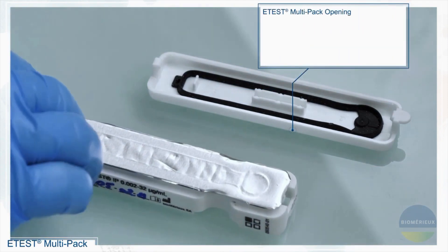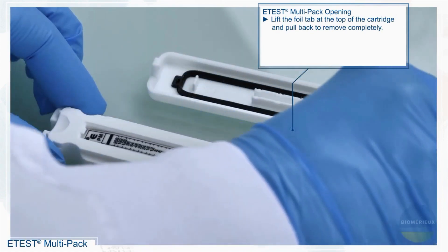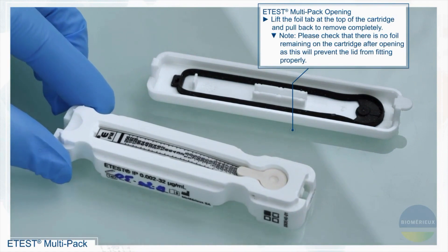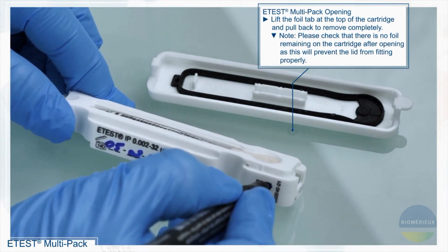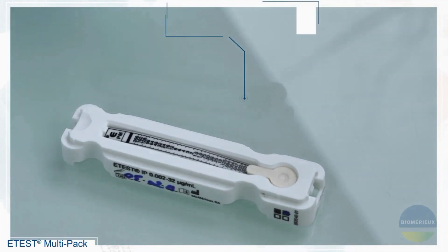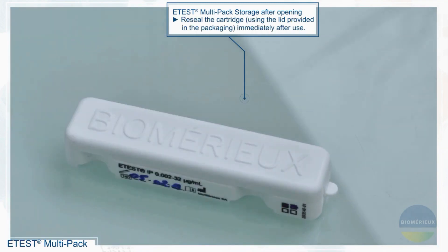eTest multipack opening. Lift the foil tab at the top of the cartridge and pull back to remove completely. Note: please check that there is no foil remaining on the cartridge after opening, as this will prevent the lid from fitting properly. Re-seal the cartridge using the lid provided in the packaging immediately after use.